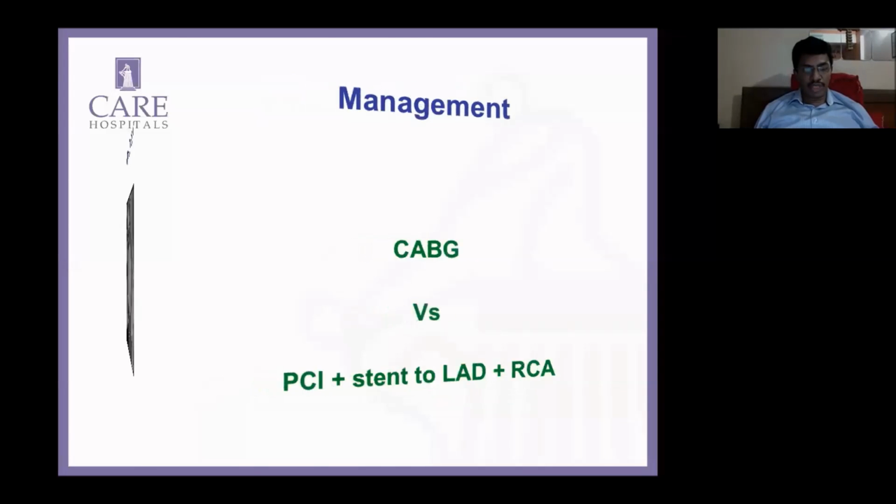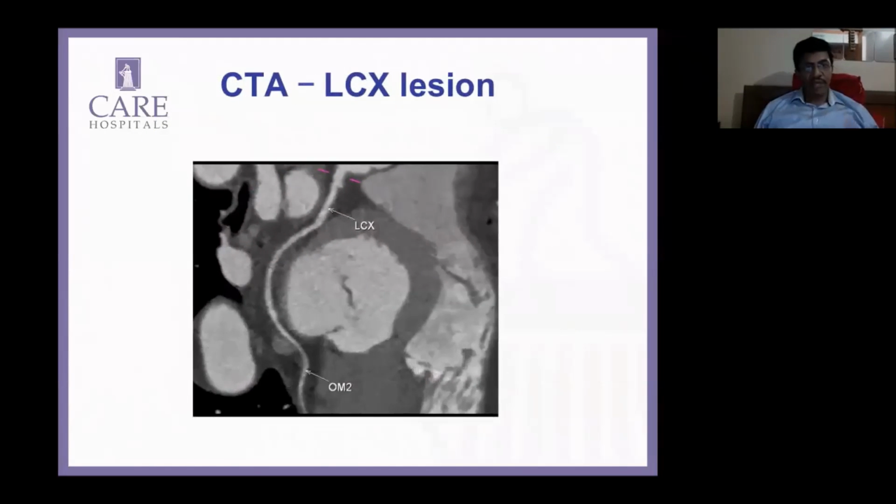Incidentally, when we do the CT scans for these patients, we look at the separation distance from the sternum to the RV, sternum to the graft, if at all there are any. We also look at patency of LIMA, RIMA, adequacy of LIMA, RIMA. So all this information is given to the surgeon. Sometimes he sits with me because we can really cut through the bone, sternum, and go in, measure distances so that he's comfortable when he's doing the redo CABG.